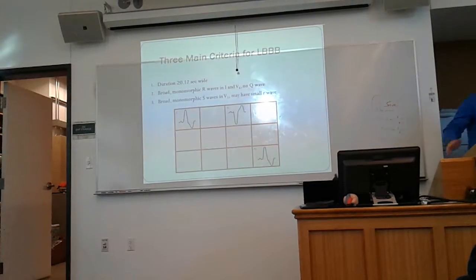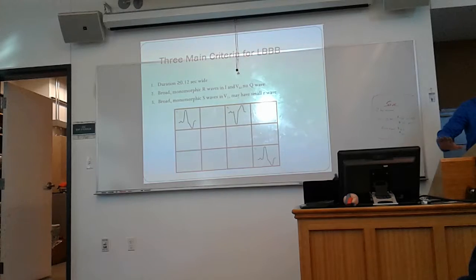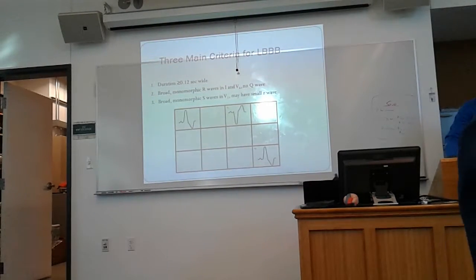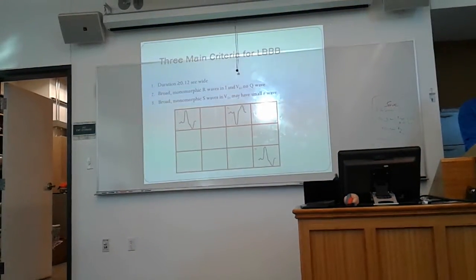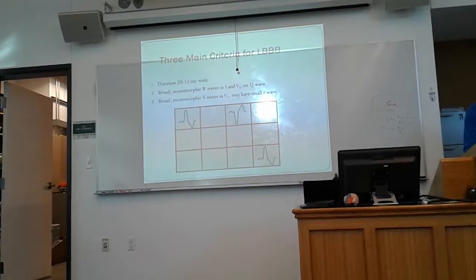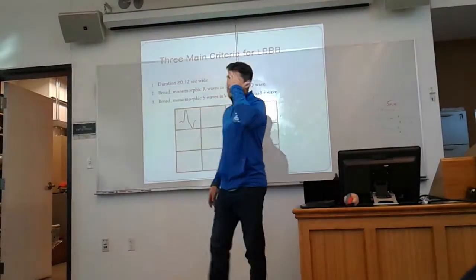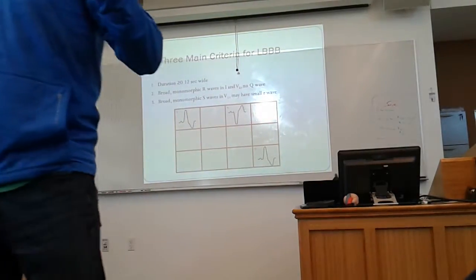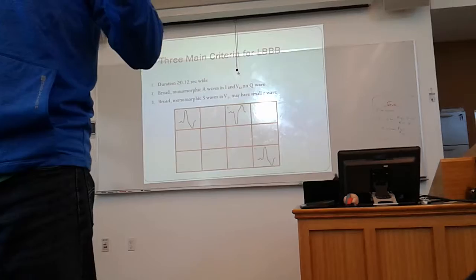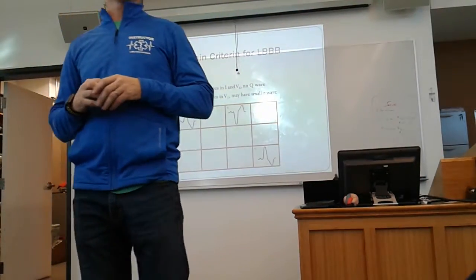Now just for fun on this one, try to cover up and isolate and just look at aVL. On number 8, just try to look at aVL for a minute. What rhythm? If aVL were the only thing that you were looking at, and we hadn't just gone through the analysis we just did, what might you have called aVL?